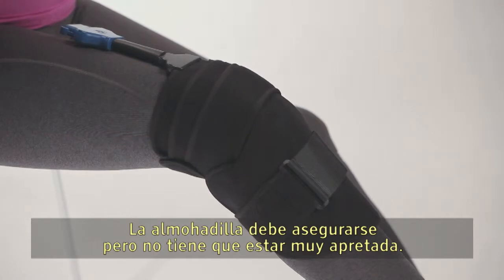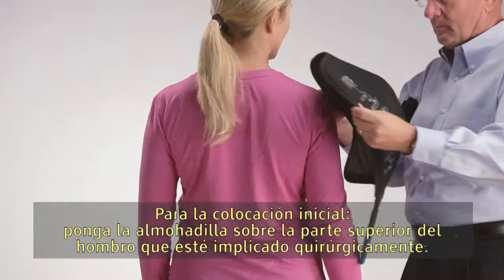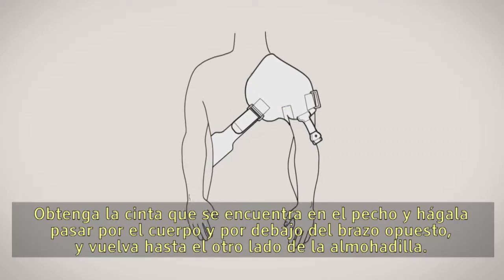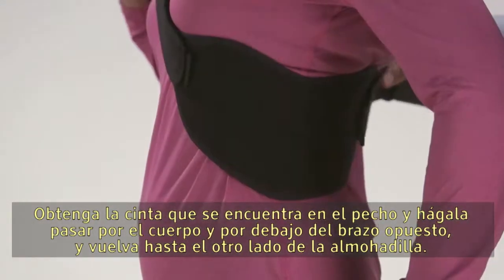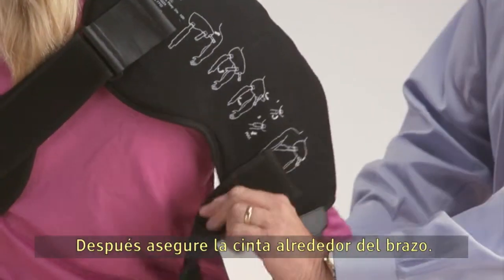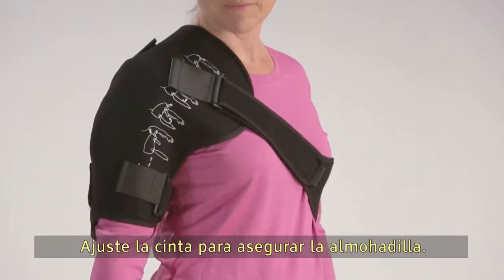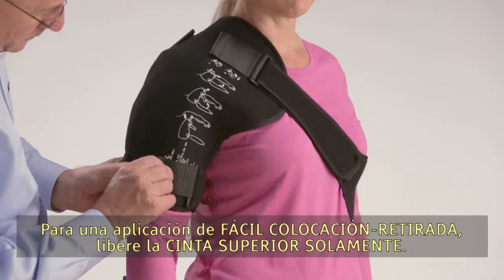For initial setup, lay the pad over the top of the involved shoulder. Take the strap located at the chest and run it across the body and under the opposite arm, then back around to the other side of the pad. Secure the strap around the arm and tighten so the pad is secure.